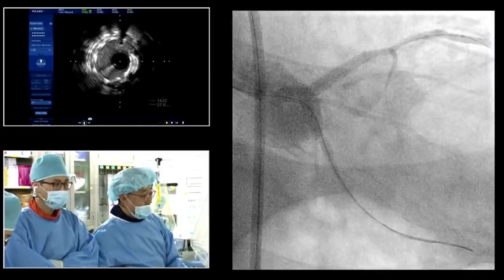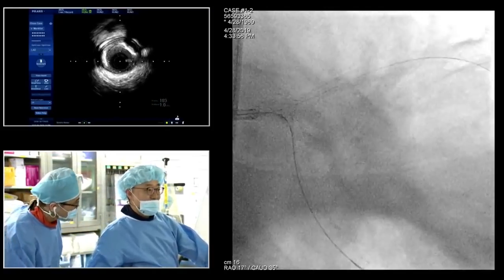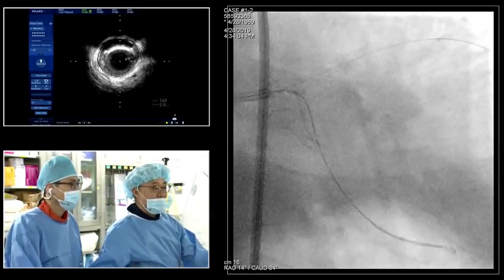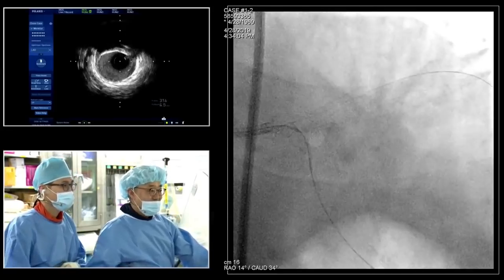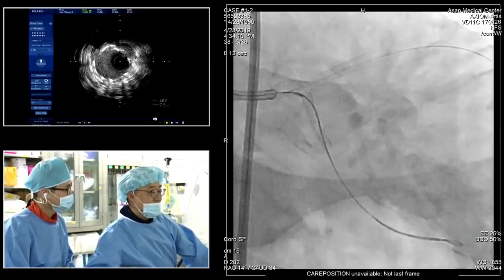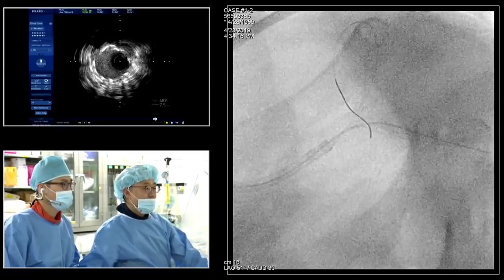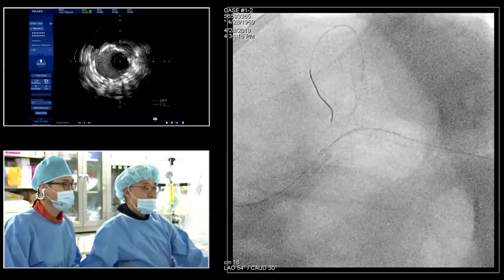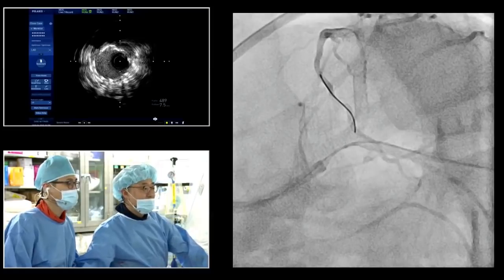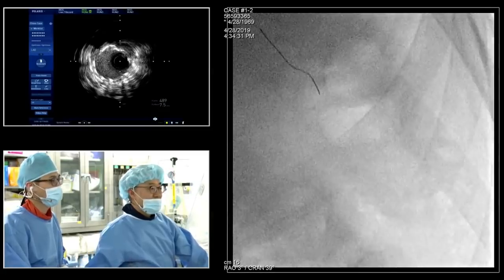Let's take a cranial view. Right, you mean some angiographic miss of ostial disease? Got it. Okay, you're ready. Full shot. Great. Then we're gonna check the spider view. Okay, going. Full shot. Okay, and then the cranial view. Good result. Very nice result.